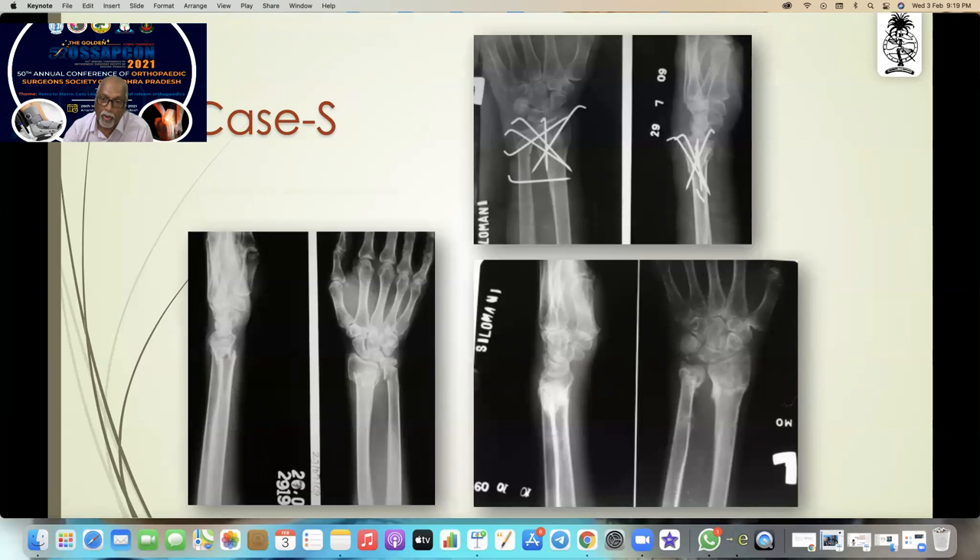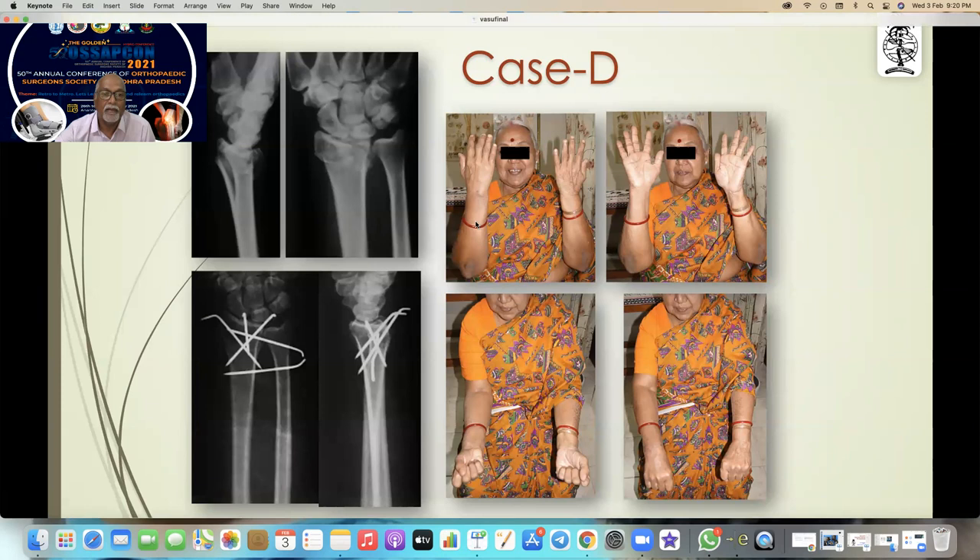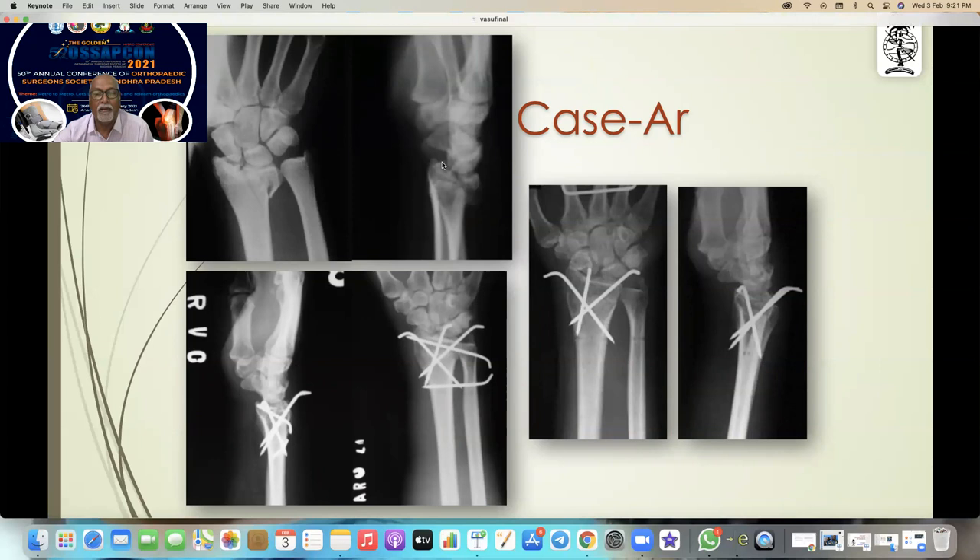An old lady with a fracture on the ulna — I stabilized the distal one by an additional wire on the ulnar head and an additional pin there, and this is after healing. You can see the grandmother with very good function. For a far distal fracture you cannot think about a plate holding that fragment — that is the end result. Here again you can see such a small fragment displaced, and that is the result.